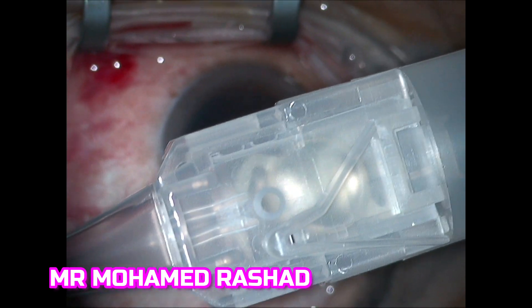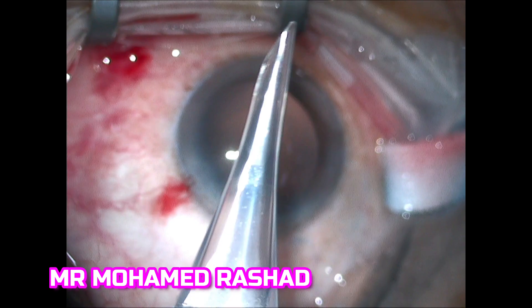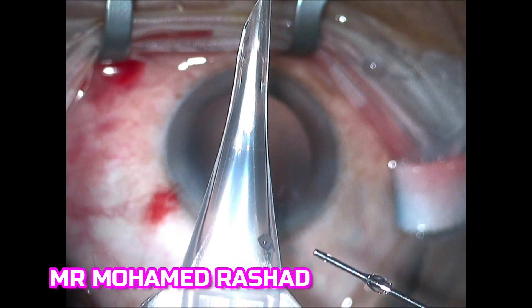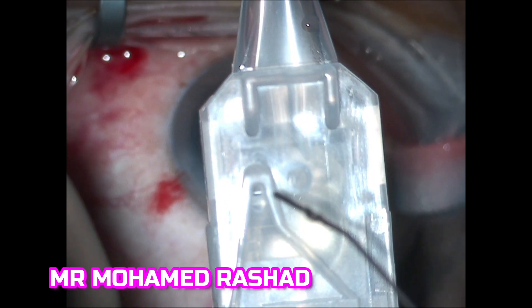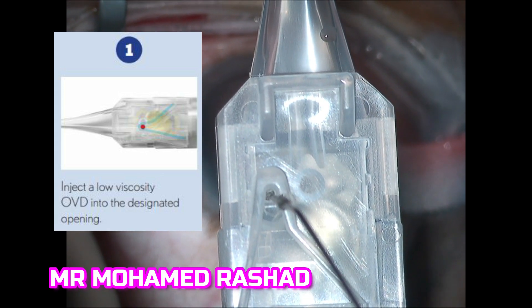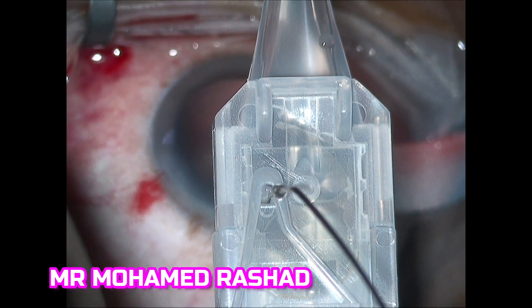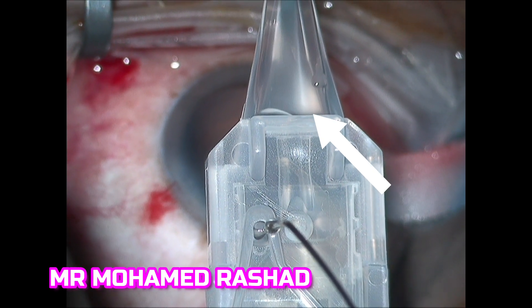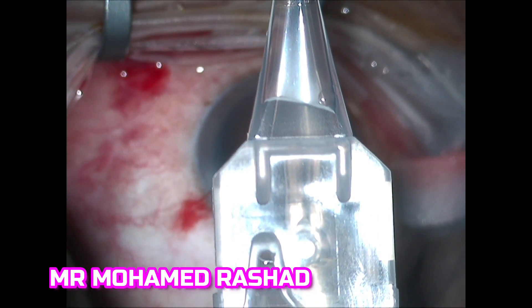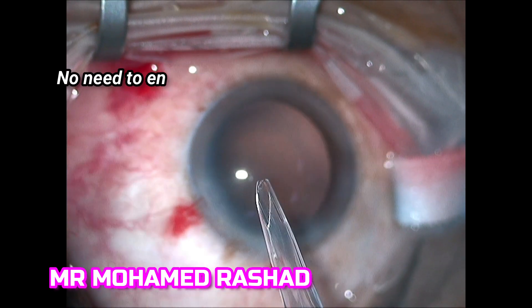Here is our case — this is the hole in the injector and this is the nozzle. You have to have the IOL inside this nozzle when you move the plunger forward. So I am putting here the low viscosity OVD. You can see now the OVD is filling the area around the IOL until the junction between the injector and the nozzle. Then you stop at this white arrow — there is no need to fill more. Then you push the plunger.